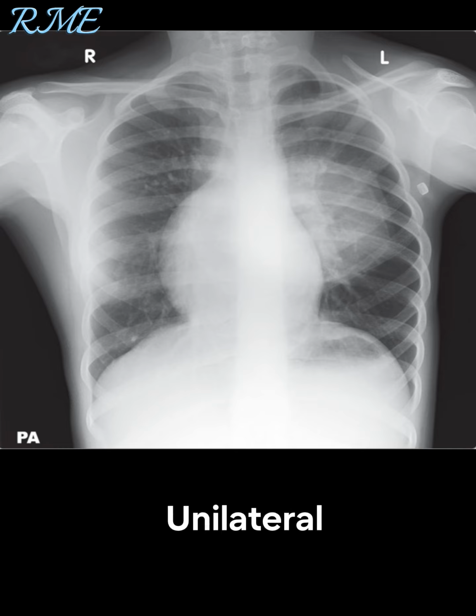When evaluating unilateral increased transradiancy, check that the side contralateral to the increased transradiancy is not abnormally dense, such as in pneumonia or pleural effusion. Differential diagnoses to consider if findings cannot be explained by technical factors include unilateral mastectomy, Poland syndrome, previous poliomyelitis, pneumothorax, emphysema, congenital lobar emphysema with air-trapping compensatory expansion, restricted arterial flow, pulmonary artery hypoplasia, a lesion constricting the pulmonary artery.